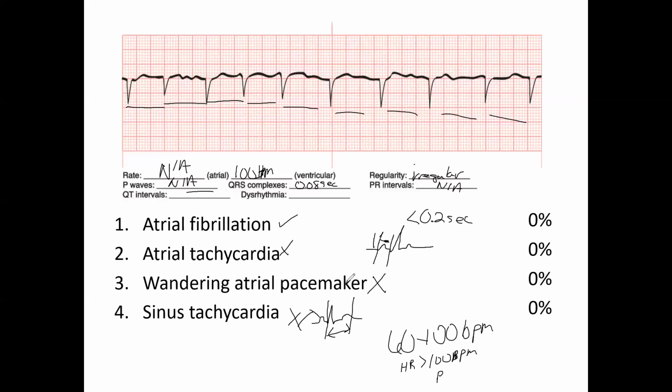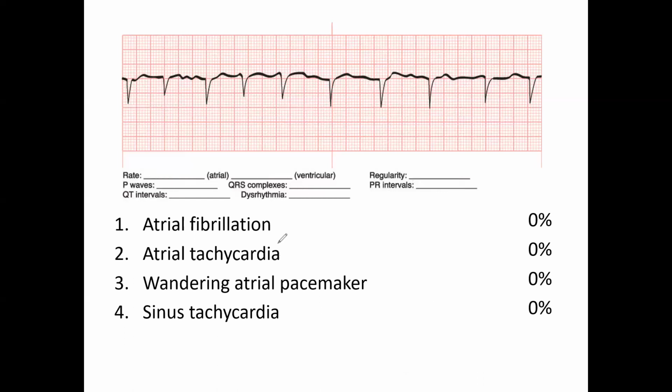So remember in class, let me clear all the drawing real quick. Remember in class, we talked about how you have some ECGs that are right side up, some ECGs are upside down. So for instance, if we go back and we draw the stick figure like we did on the board, we know this is the patient's right over here, patient's left is over here. You know that you've got an electrode here, an electrode here, an electrode here, and an electrode here. Those are going to help create your augmented leads as well as your standard limb leads. And then you've got V1 through V6. So your 10 electrodes create the 12 leads.